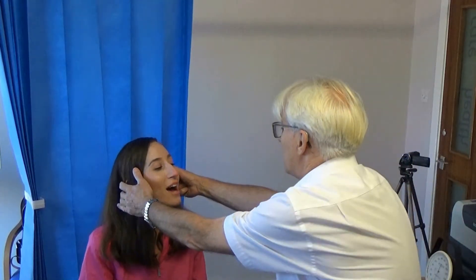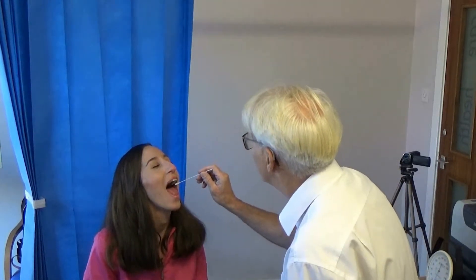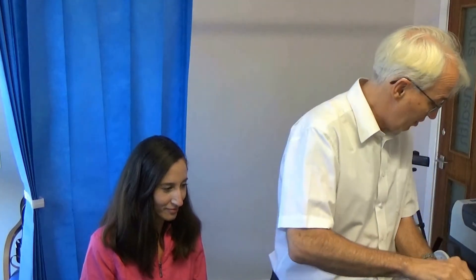Then go on to take the pharyngeal swab. Ask the patient to look up towards the ceiling, open their mouth as wide as possible, and tilt their head back a little bit. I just tend to look for the side where the tongue is lowest and take a bit of the posterior pharyngeal space. Then again just break that off into the bottle. If you look for that little groove it's easy to break off. Pop the lid on.